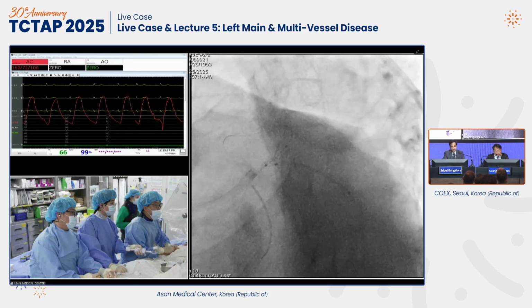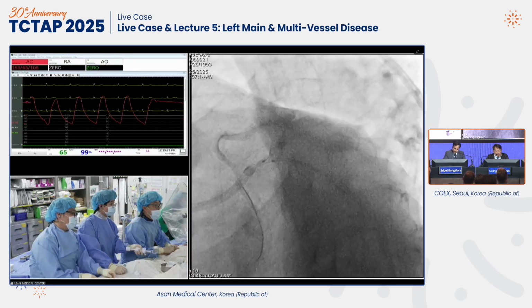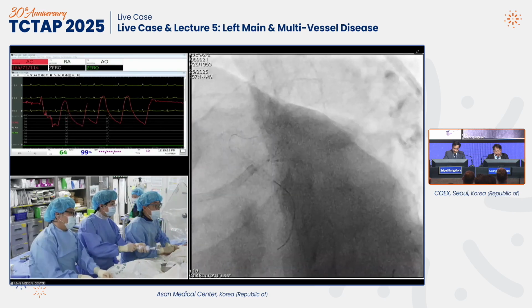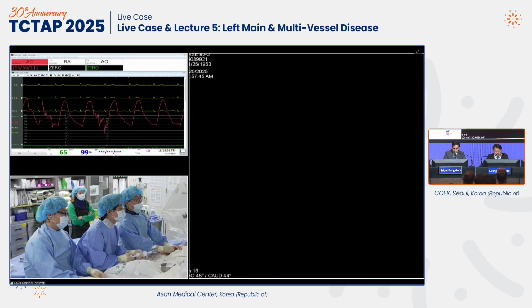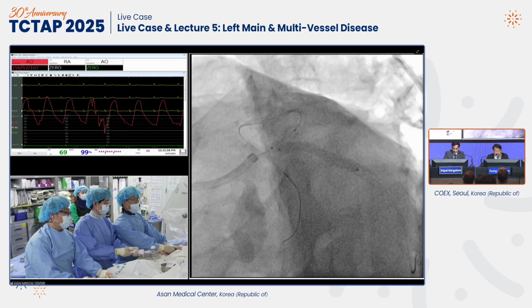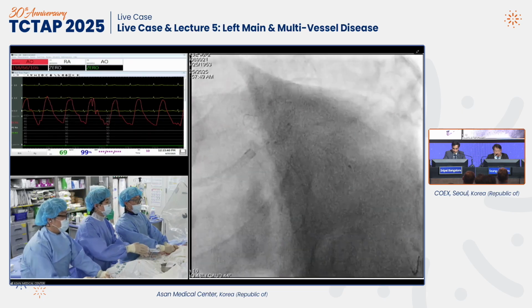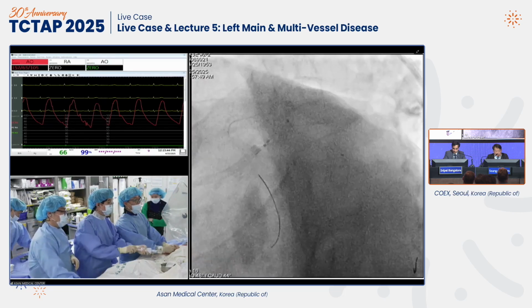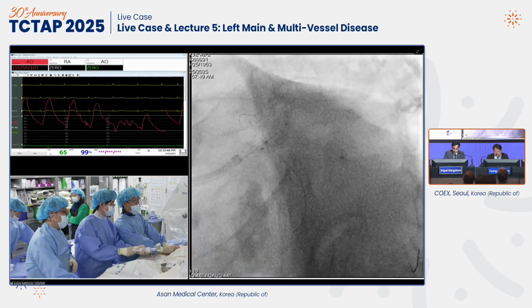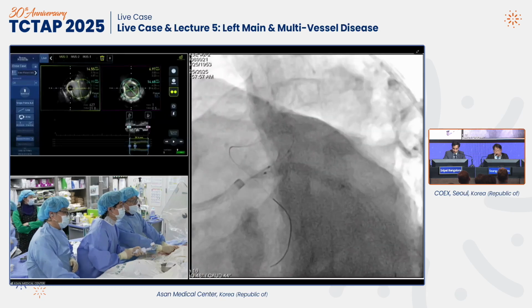Good position. Okay, test. Okay, go, inflate. Okay, 11, 10, 12. Okay, deflate. Depression. Pullback. Okay, 10, 12, 14, 16. Okay, deflate.